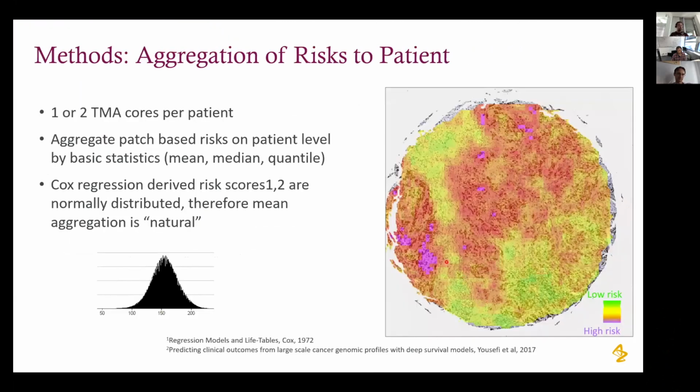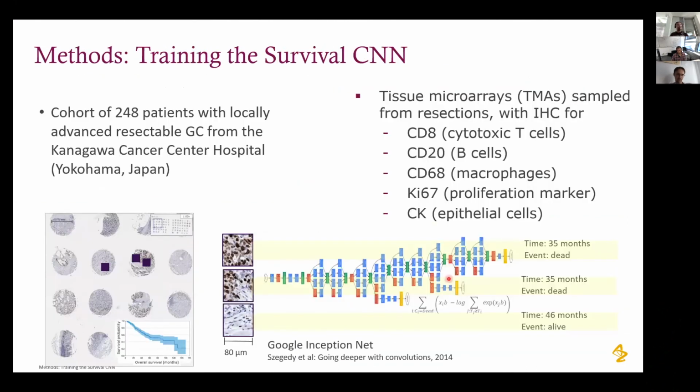One more thing I would like to note is that we are not limited to only this feature. We can plug in any kind of genomic feature or NanoString feature to this layer and have combined learning of image plus genomic features, an end-to-end learning. Maybe this is interesting for the community in general: how do we do multi-omics analysis in this kind of setting.